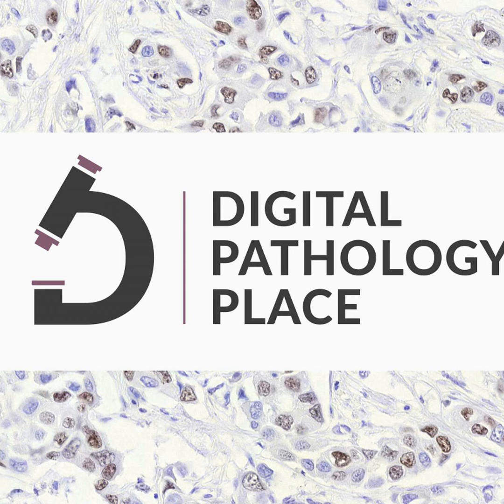So for anybody who's listening that's not as familiar with the difference between cytology, which is what I just described, and histopathology, which is what Alex does as an anatomic pathologist, there's just not really any processing aside from staining in the clinic that has to be done. So it makes it a point of care kind of test that can be done inside of the clinic.